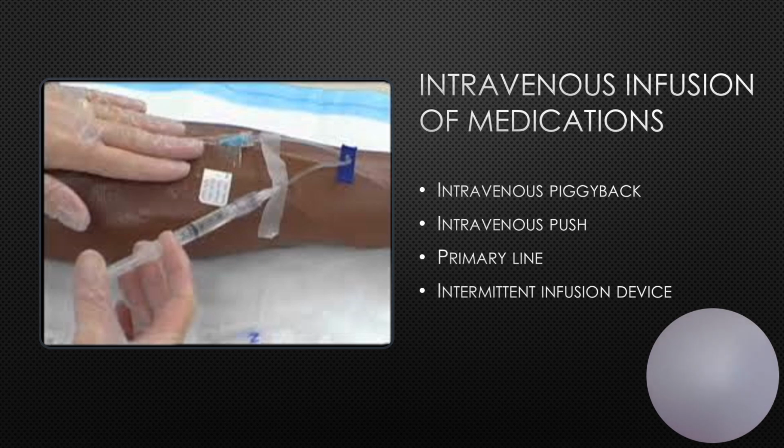So determine the compatibility of the medication and the fluids that may be infusing in a continuous infusion prior to administration. Again, if it's incompatible, it can cause precipitates or cloudiness. If it is incompatible, we have to flush before and after medication administration. I encourage you to do this regardless of whether it's incompatible or not. Scrub the port between every flush, medication, or infusion.